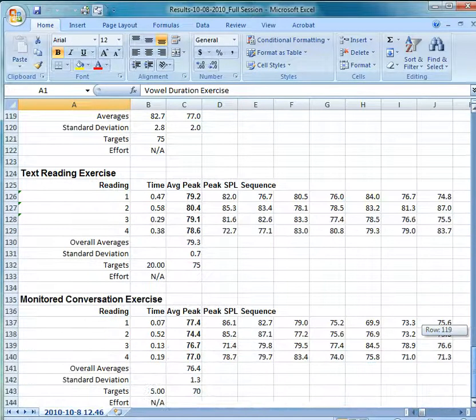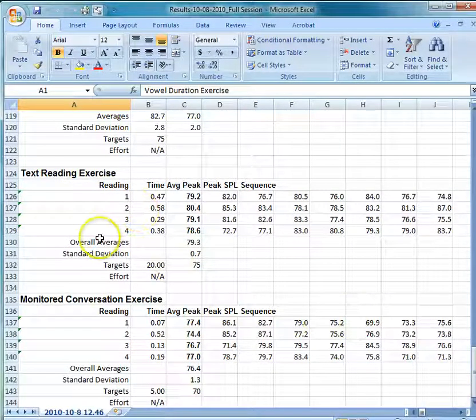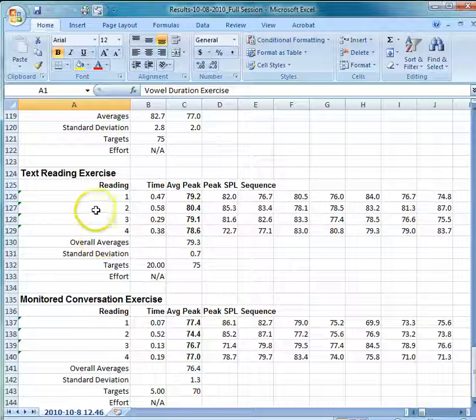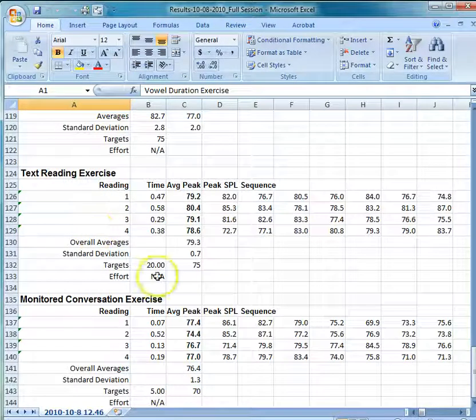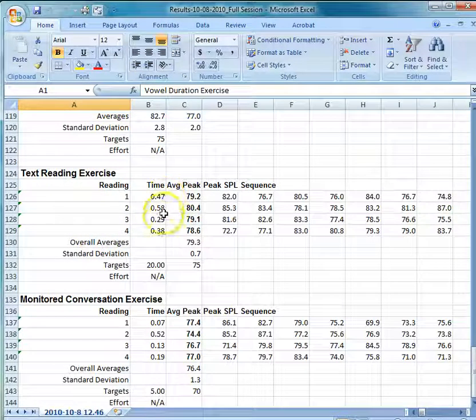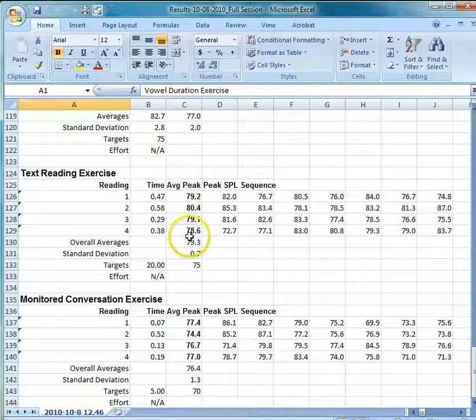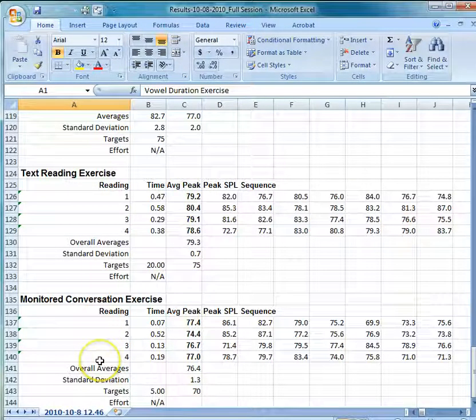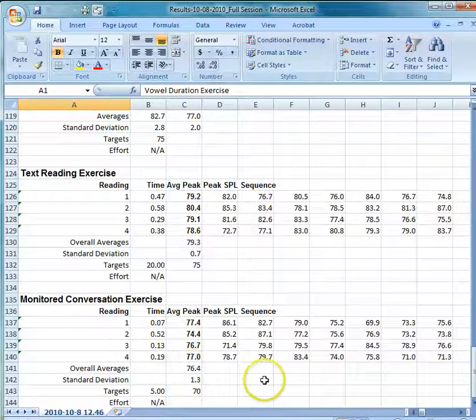And finally, any text reading or conversation. In this session, there were four different text reading sessions, the average time of each of those sessions, and the average SPL, as well as four monitored conversation activities — the time or duration of those activities and the SPL.